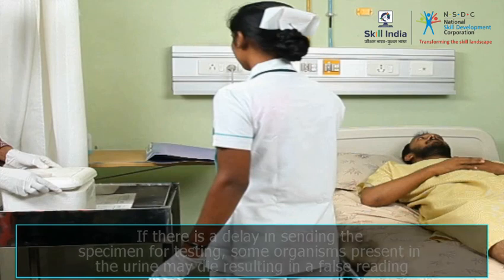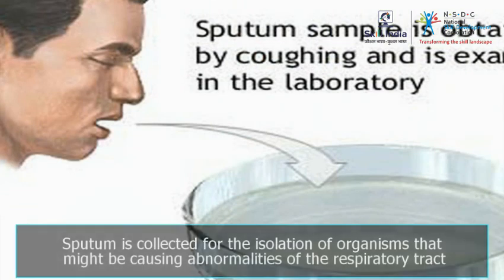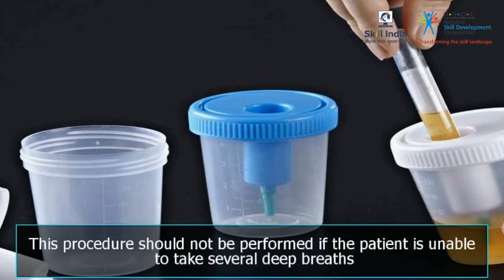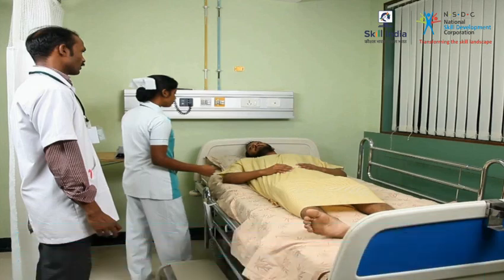Sputum specimen collection is a procedure designed to collect expectorated secretions from a patient's respiratory tract. Sputum is collected to be used as a laboratory specimen for the isolation of organisms that might be causing abnormalities of the respiratory tract. This procedure should not be performed if the patient is unable to take several deep breaths or cough deeply from the lungs.